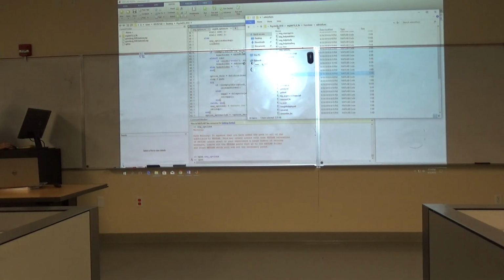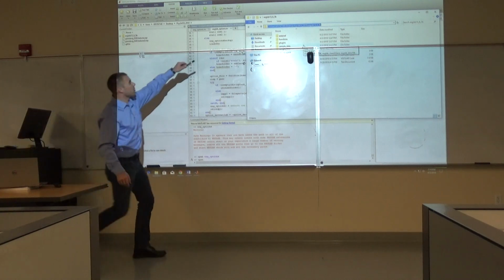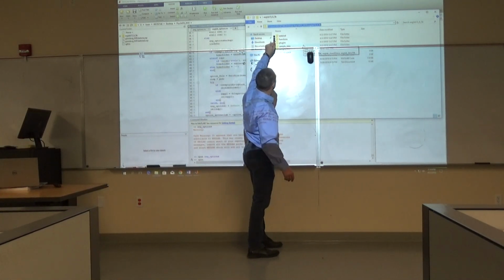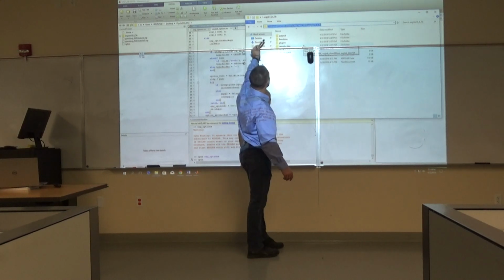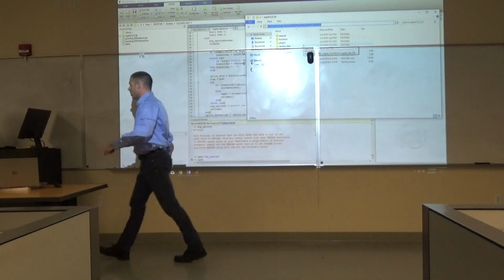The desktop, so C users, my school ID, desktop, the Psych433 folder, and then the EEG lab. Okay, so you guys see how I did that? Yeah. So we're going to come up here, and as long as you grab that folder and put it in EEG lab, then you can.